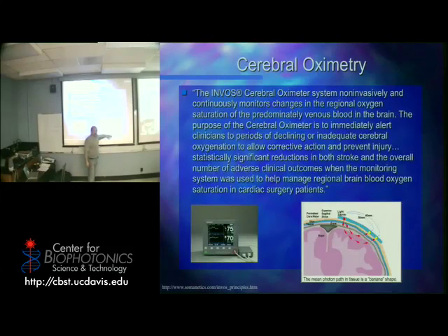If we shine light and this part of the brain is active, we should see some kind of change over time. And because all we're doing is shining lights and measuring the stuff coming out, we can do this very quickly. And we can look for changes. So, what do we do? We put a little skull cap on you. The little skull cap has 4, 8, 16 really, really bright lights, sometimes lasers, sometimes LEDs, with little detectors at the appropriate distances. We pulse that light, same way that we do with pulse oximetry, and we see how much is coming through, and then we make a map of where there's activity in your brain. We can actually see if you're activating parts of your brain versus other parts of your brain.